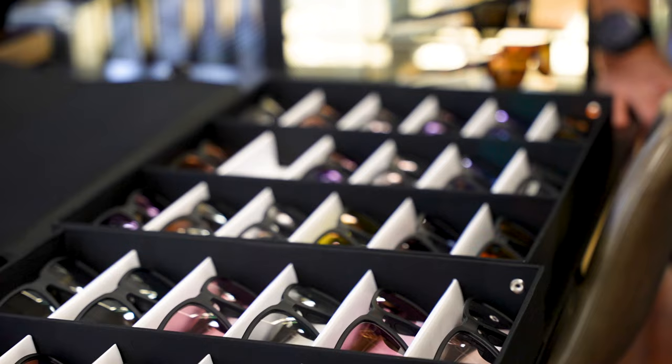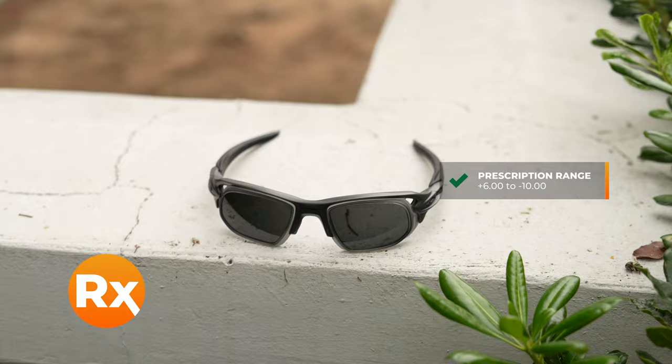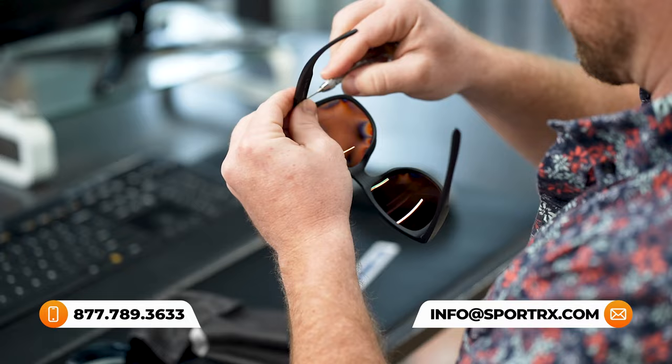Now let's get to my favorite part — the RX range for this frame. The Flak RX Dock can go from a plus six all the way to a minus 10 total power. And if you have questions on what total power might mean, we have other videos you can check out discussing that, or give us a call. We have live opticians standing by who would love to discuss the details of your prescription and even help you get an order started.